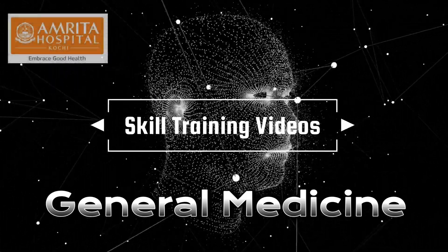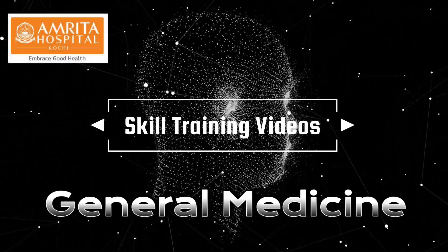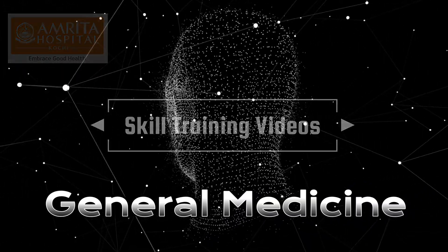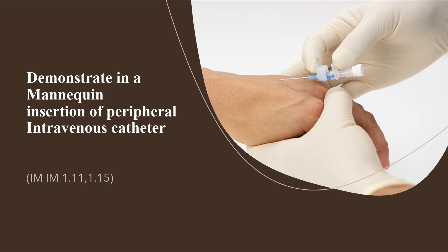Welcome to the skill training video sessions, a department of general medicine initiative. The skill that we are going to look at today is the insertion of a peripheral intravenous catheter in a mannequin.